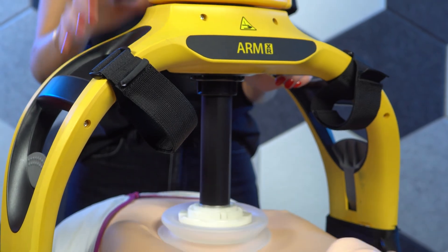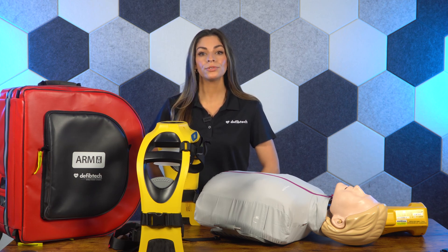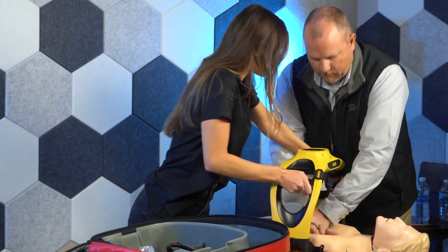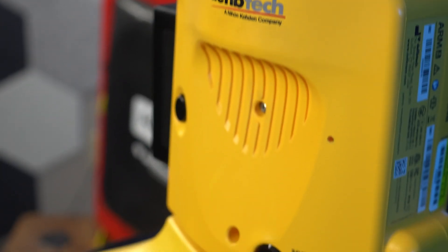The ArmXR is designed for quick, streamlined deployment, allowing first responders to transition from manual to mechanical CPR without missing a beat. The improved frame snaps into place through the arms of someone performing manual CPR. Once assembled, the control panel lowers the compression piston to the patient's chest.